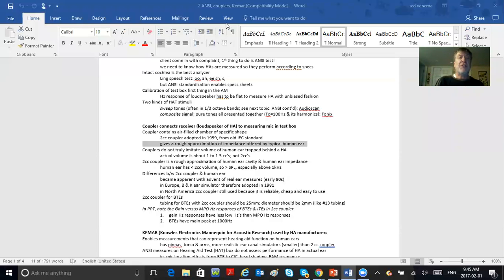I've got my hands like so, okay? And I've got 70 dB coming out, and it's coming in this room. Well, what if I make the walls of this room come closer and the ceiling and floor of the room come closer, like a nightmare movie? Well, that 70 dB is going to turn into 80, is going to turn into 90, right? Because it's going to bounce off the closer walls. That's the same thing as happens in a real ear.